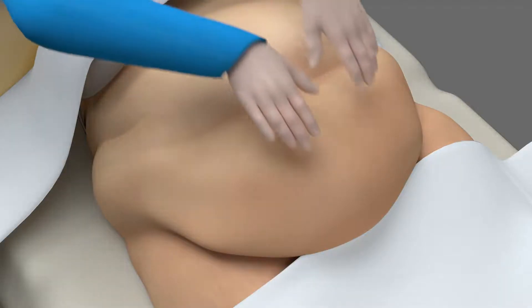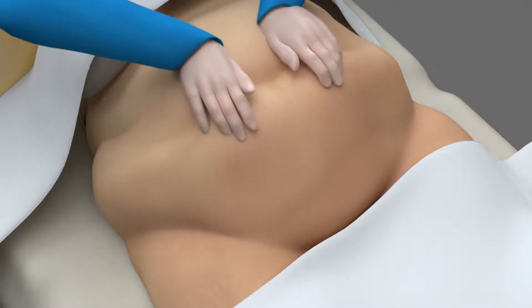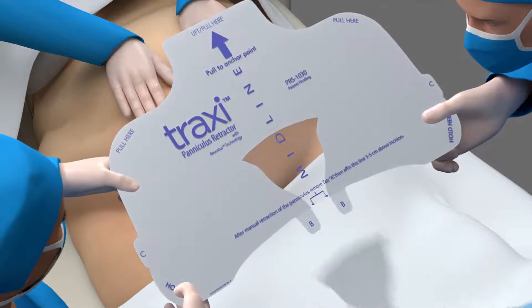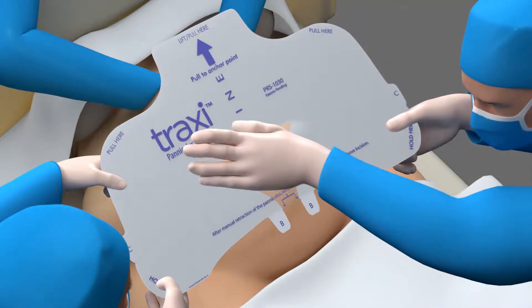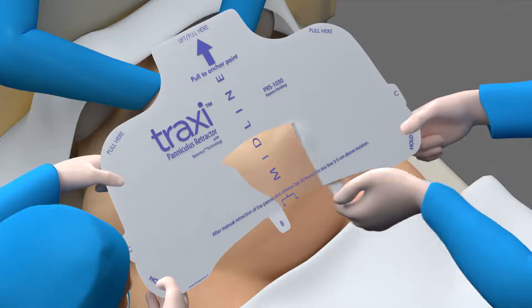Step 2 is to remove Tab A. Expose the surgical site, manually retracting the paniculus if necessary. Hold the Traxi above the patient's abdomen and one staff member should remove Tab A and discard the tab. Position the retractor five centimeters above the incision site. Apply to the patient using manual pressure to secure the device to the patient's abdomen.